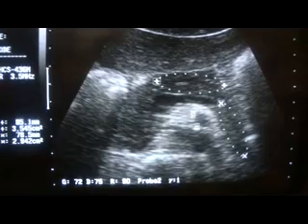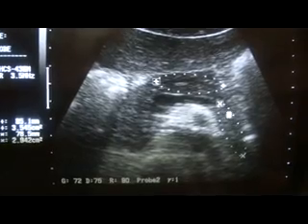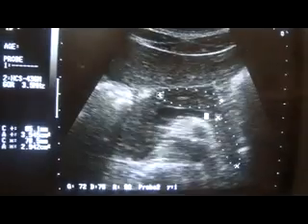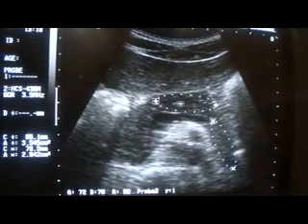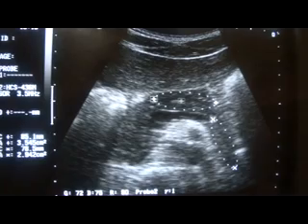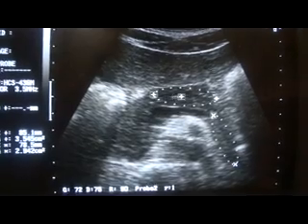you are getting the total pancreas. This is the head of the pancreas, this is the body, and this is the tail of the pancreas. This is the liver, normal liver, and these are the duodenal bowel gases.